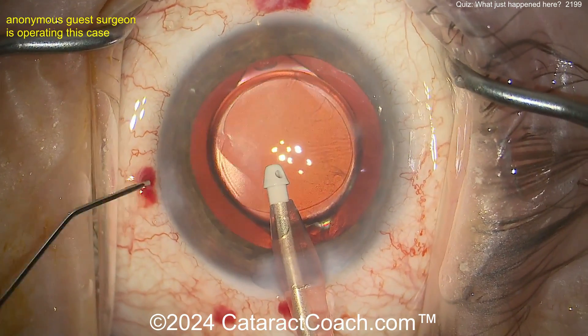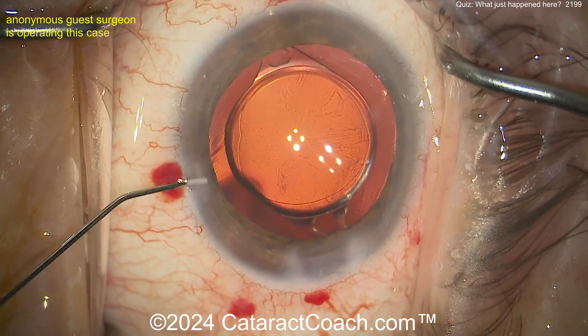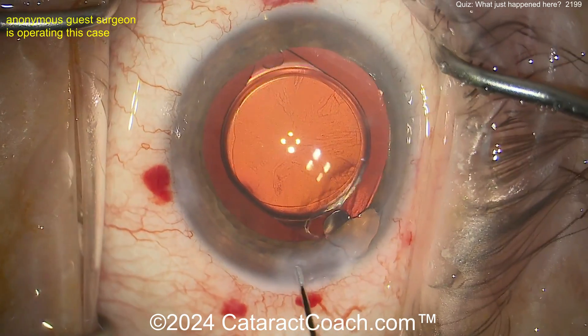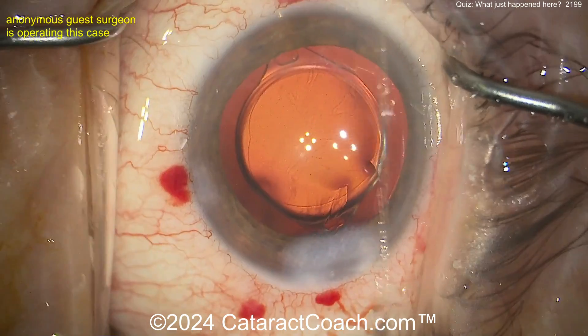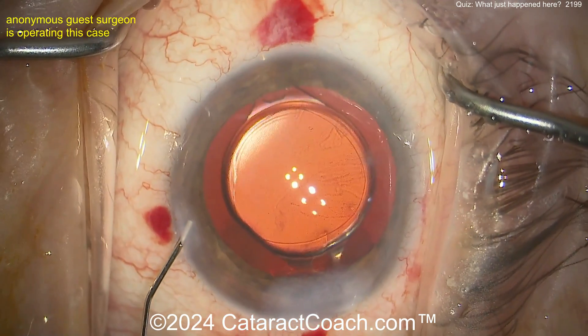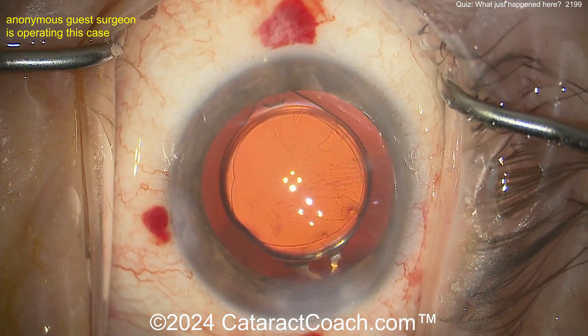As long as you don't do any more damage — you know, grabbing the capsule — you're fine. Another smart move: don't let the AC collapse. Let's seal up the incision here, keep that AC nicely formed. This case will have an absolutely beautiful outcome and literally no consequence or negative sequelae from that iatrogenic clock hours of zonular loss.